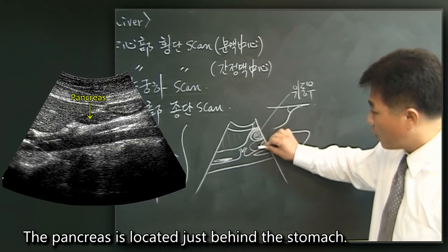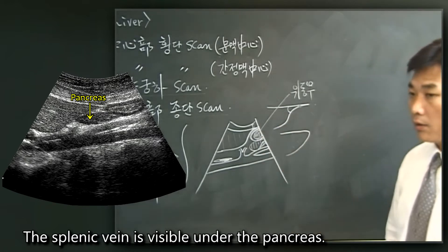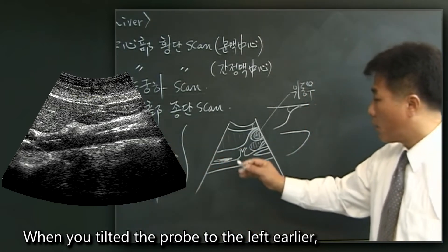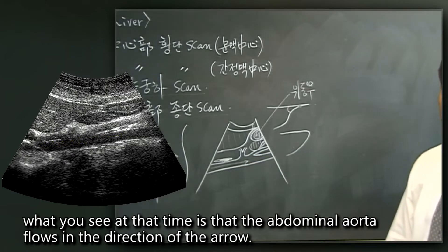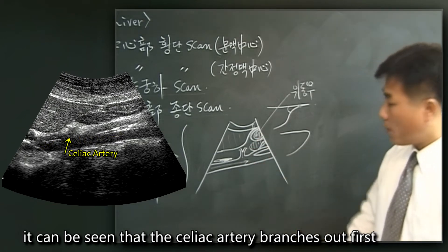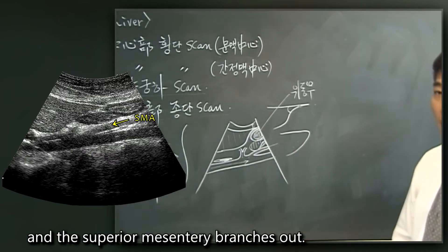The pancreas is located just behind the stomach. The splenic vein is visible under the pancreas. When you tilt the probe to the left, you can see that the abdominal aorta flows in the direction of the arrow. From the abdominal aorta, it can be seen that the celiac artery branches out first, and then the superior mesenteric artery branches out.